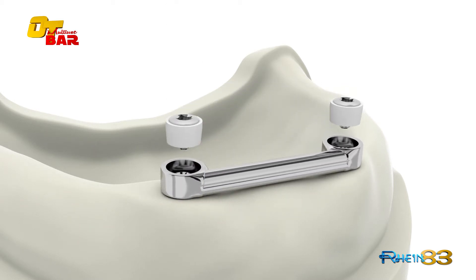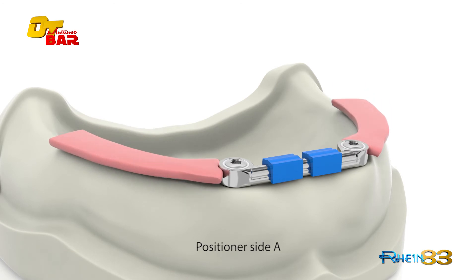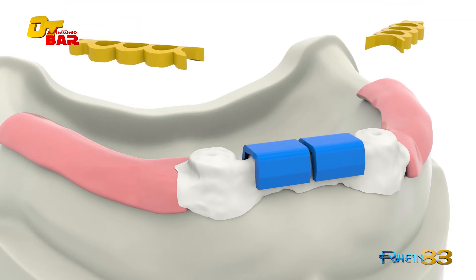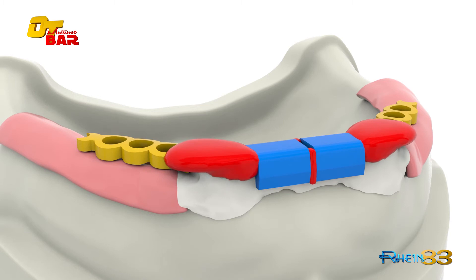To create the frame directly over the cast bar, choose the positioner clip for side A and insert it. Use the gingival connector to extend the frame and complete the structure with self-curing resin.